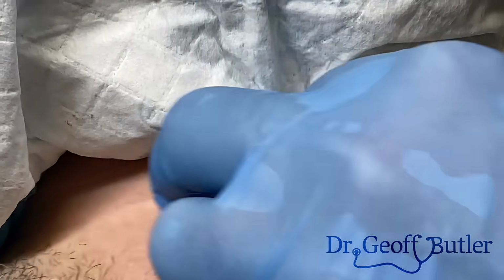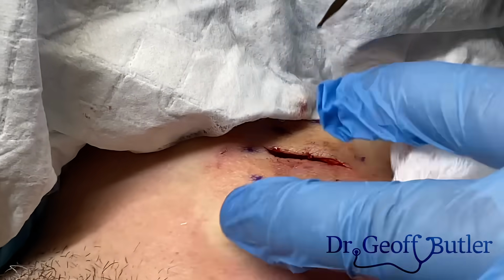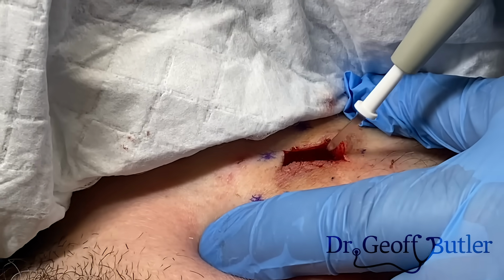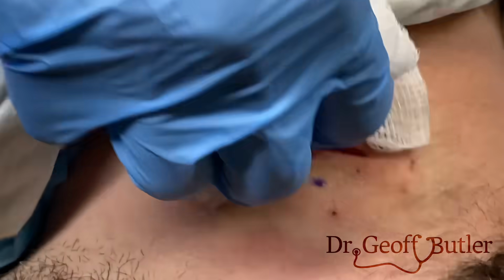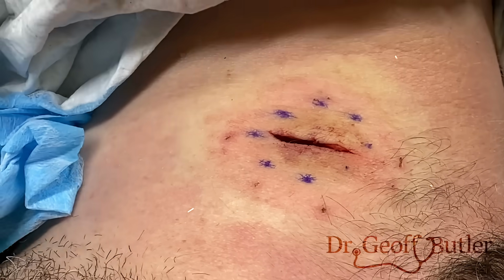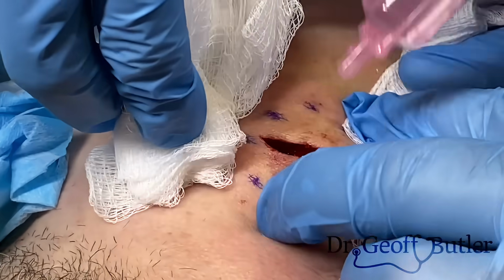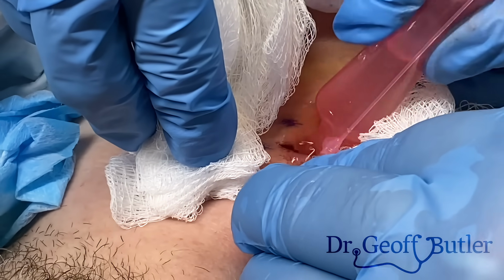Oh, I feel that one. See, that's where I try. That muscle fiber there is harder to freeze, so this is where I'm going to try and avoid that. And I don't need to actually cauterize through there anyway, so do a little bit more here. That should be good. So certainly if I was doing more work in that area, we would freeze that area more because we don't want to do anything uncomfortable. A little cold. A little wet, sorry. Actually, you just feel a weird sensation.